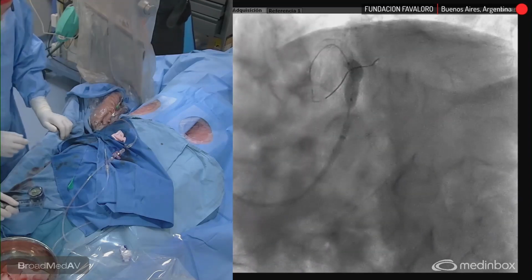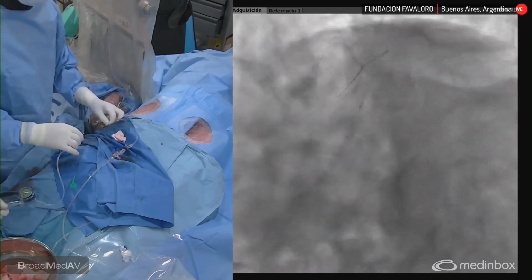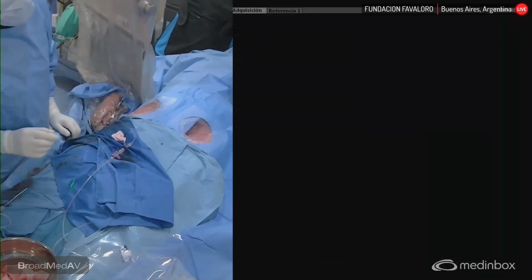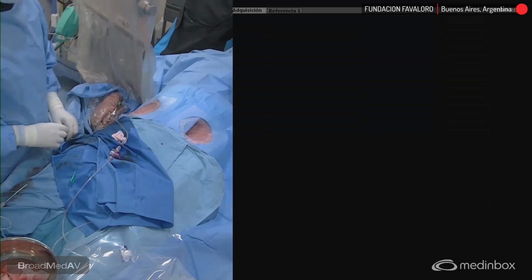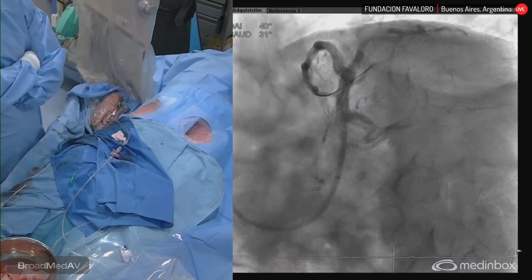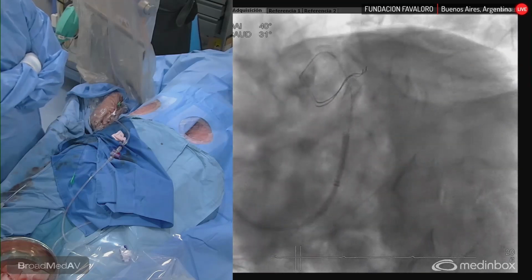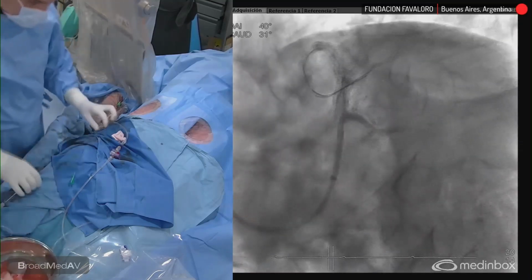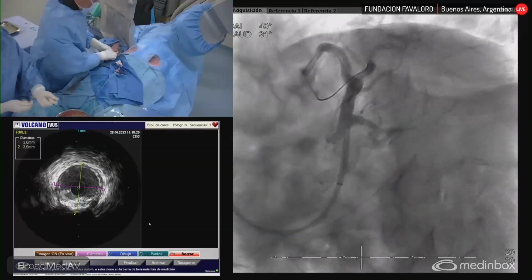The importance of the guiding catheter in this case is, deflate, they're very important because they not only help us to get any device inside the artery, but also, if we have a perforation, to help us with the stent graft. Absolutely. Yes. In these tortuous arteries. So as you can observe, the diagonal is perfect with absolutely normal flow. I don't think we have to go for a kissing balloon there. No. What I would do is IVUS on the LAD to see if I need post-dilatation there. So bring me the IVUS.